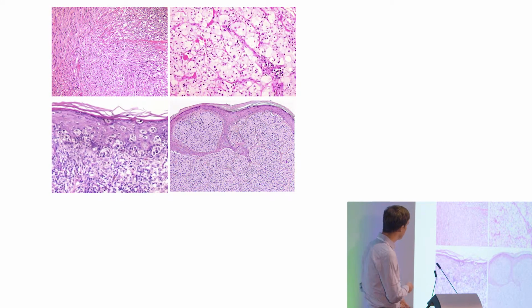So these are examples of what we see under the microscope. These are melanoma tumors that have been stained with dyes, and here we can see the cells forming the tumors. The reason I've put this slide up is to show you how incredibly variable in appearance different melanoma tumors can be. You can see these four all look very different from each other, and because of this, melanoma diagnosis is actually one of the most challenging areas in the whole of diagnostic pathology.